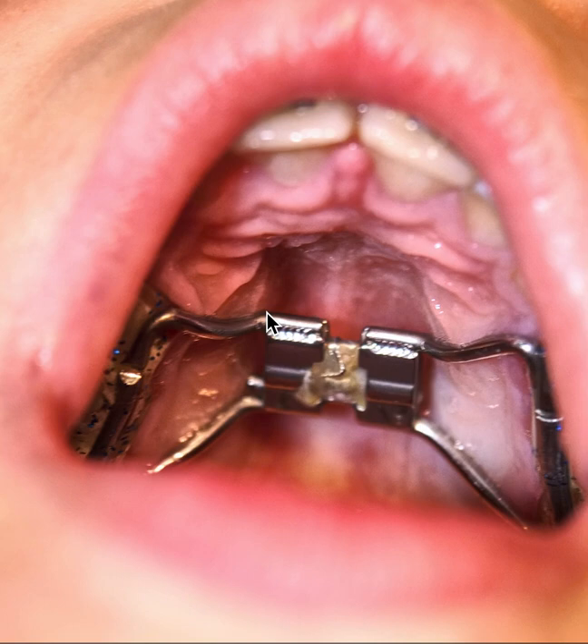This is Dr. Amanda with Straight Smile Solutions and today we're going to be talking about rapid palatal expanders, or palatal expanders in general. We call them RPEs, all sorts of names for them.